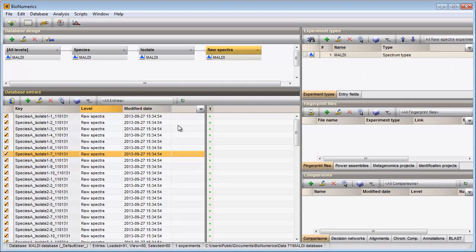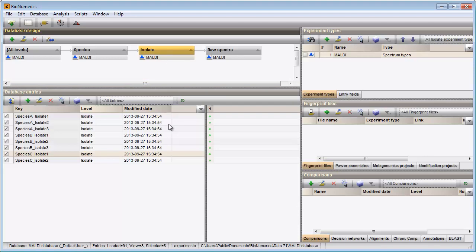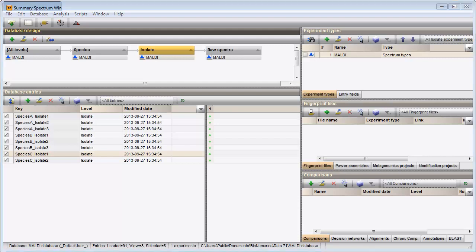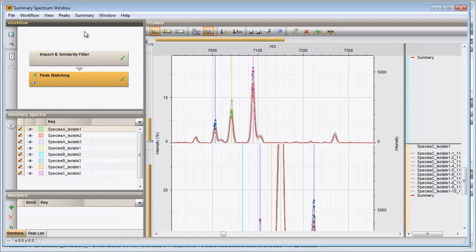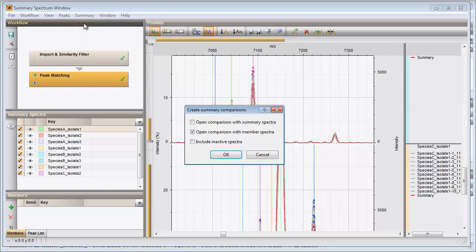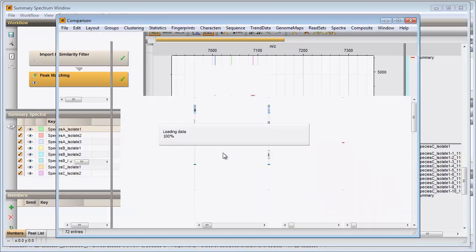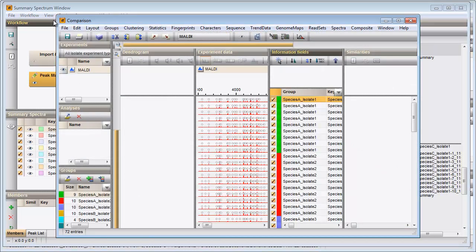Each entry in my database at the isolate level now has a linked MALDI experiment. I can have a look at the quality of the raw spectra and the summary spectra by creating a comparison. I select Summary, Create comparisons. I choose the second option and the comparison window opens, including all member spectra grouped according to their summary spectra.